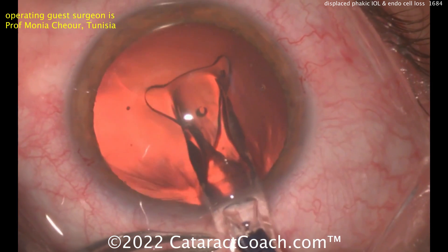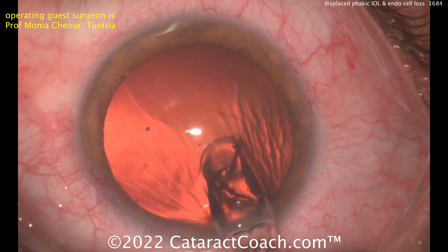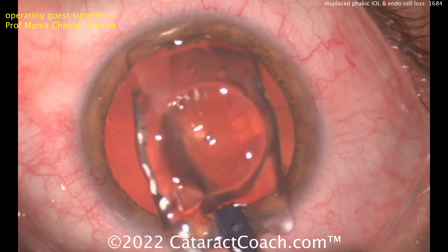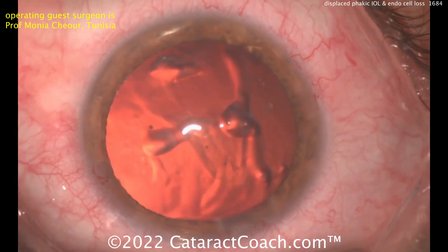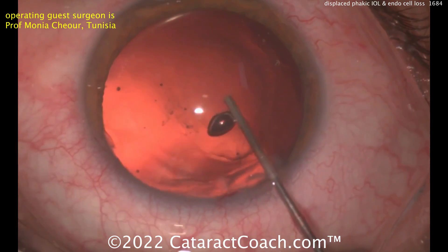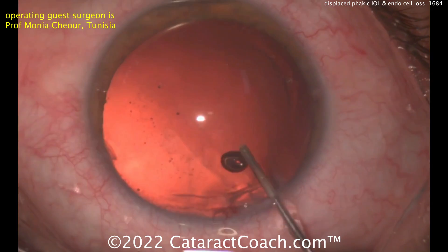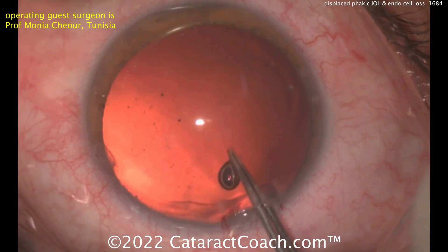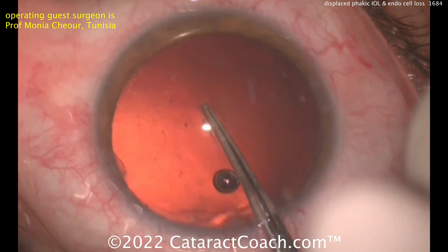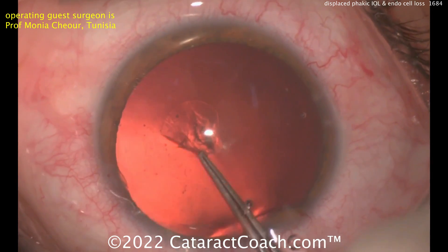When I first saw this video, I did email the surgeon and asked her how come she didn't do something else — why did she remove the lens and also take out the crystalline lens? And then we got forwarded those endothelial cell counts, and what a difference. A really big loss of endothelial cells. If you've lost from 2,400 to 1,600 in a year, that's really not a good prognostic sign. So in this case, the choice was made for the patient to become pseudophakic and correct the refractive error that way.